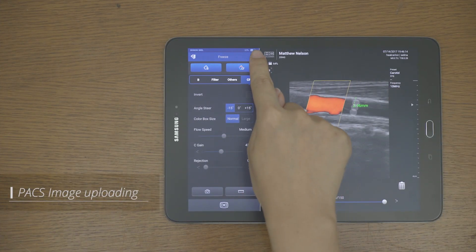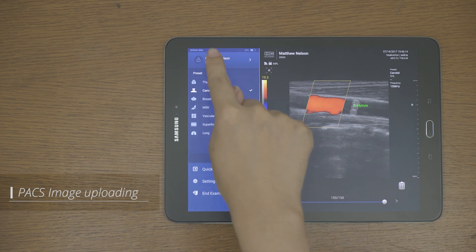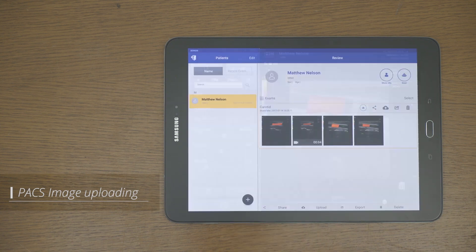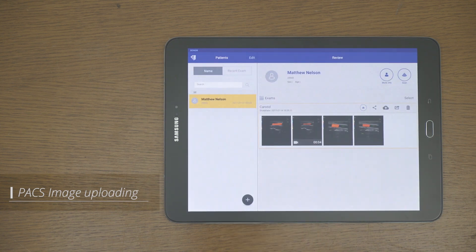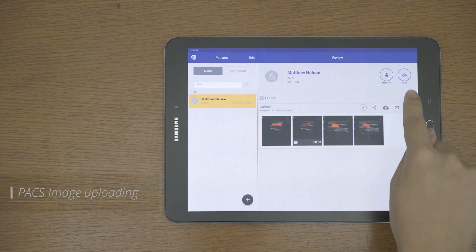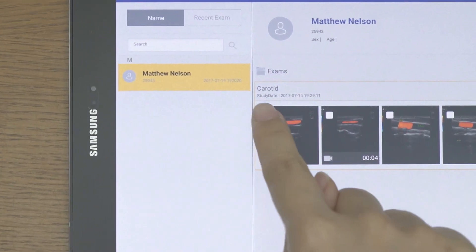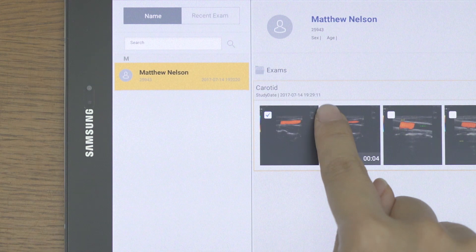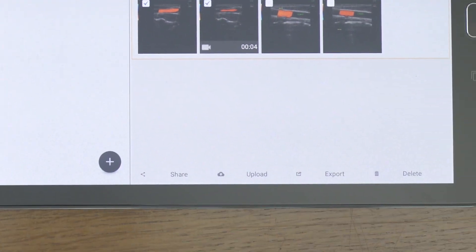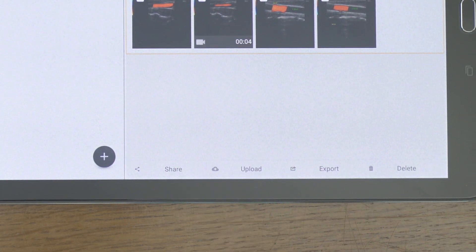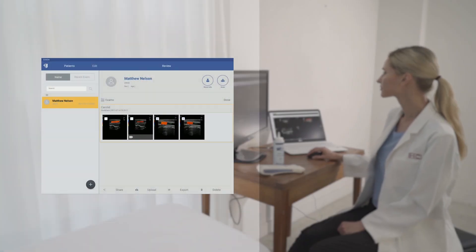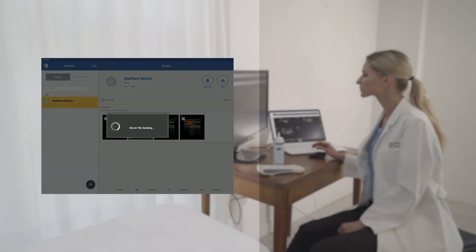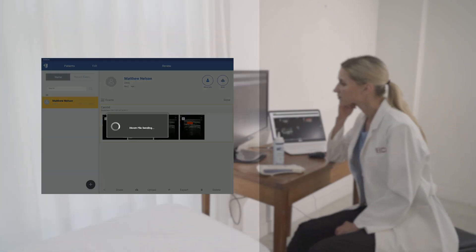The saved image can be uploaded to the PACS from the patient screen. Select the image you want to upload and tap the upload button to complete the transfer to PACS and check it on your PC as well.